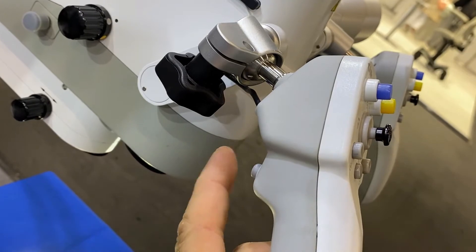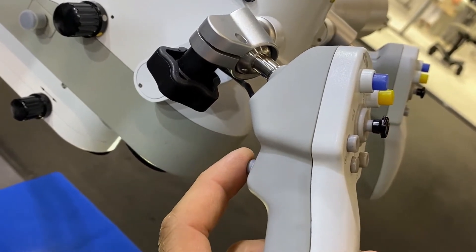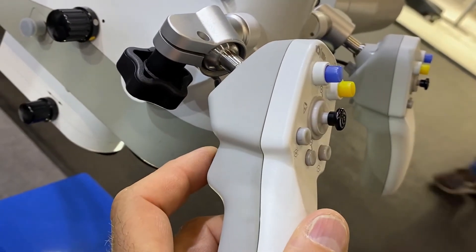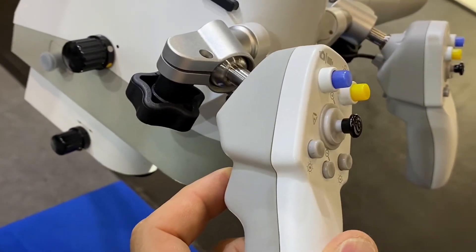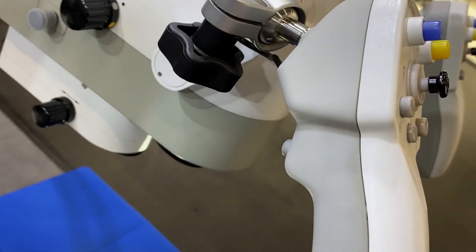The activation of the magnetic brake is always on the bottom of each side of the grip. So if I push the button here I lose the magnetic brake and if I let the button go the microscope is fixed again.